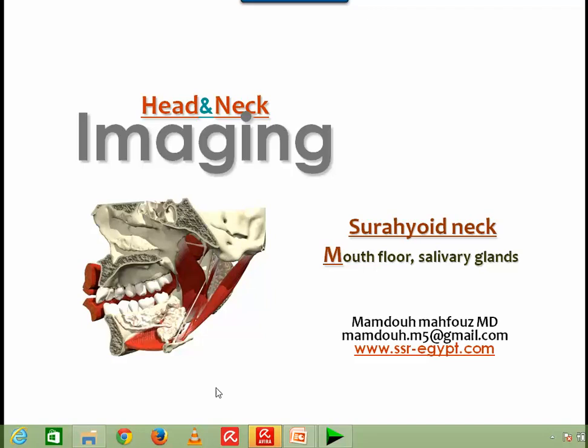In the suprahyoid neck, we usually deal with the imaging of the floor of the mouth as well as the salivary glands.